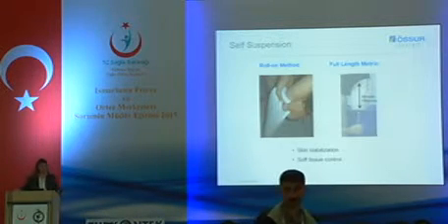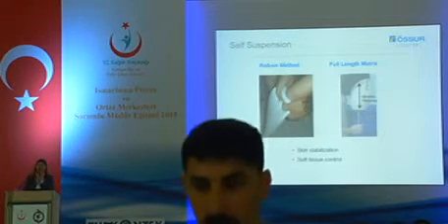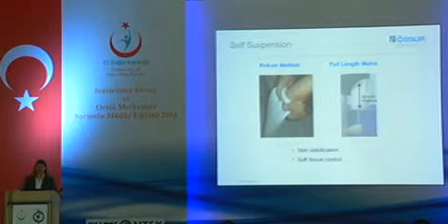So liners are self-suspending. They are rolled on to make sure that the soft tissue is elongated and stabilized.